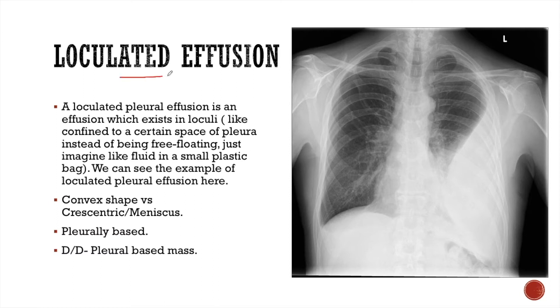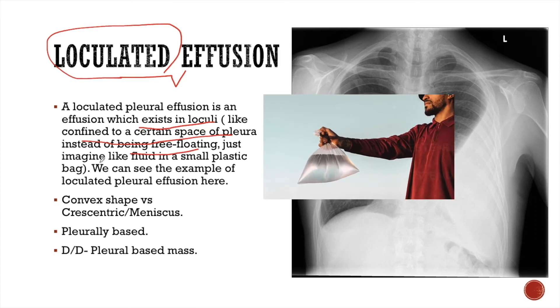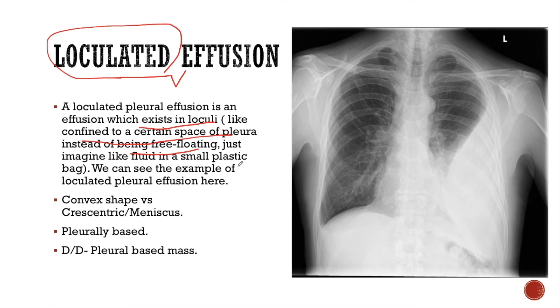When pleural effusion does not lie in the dependent area forming a meniscus, it is known as loculated pleural effusion. A loculated pleural effusion exists in loculi — confined to a certain space of the pleura — instead of being free-floating, like fluid in a small plastic bag. In this example, the pleural fluid lies in the left lateral aspect of the thorax and has a convex shape instead of a meniscus. This convex shape is the hallmark of loculated pleural effusion.